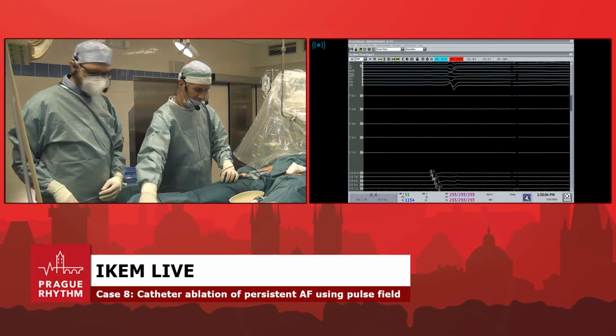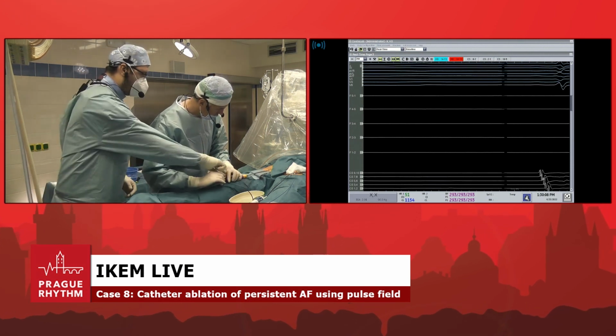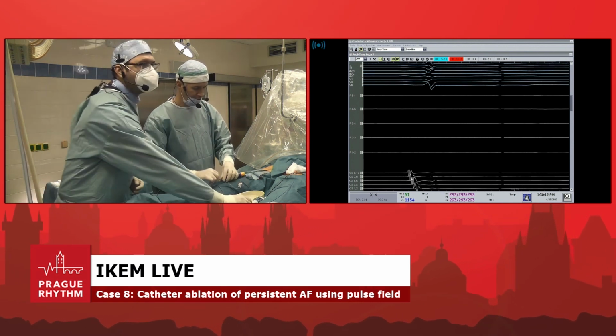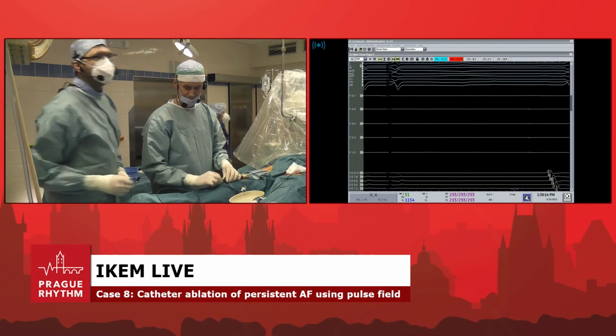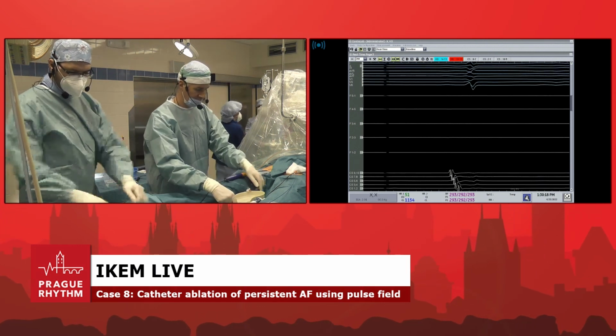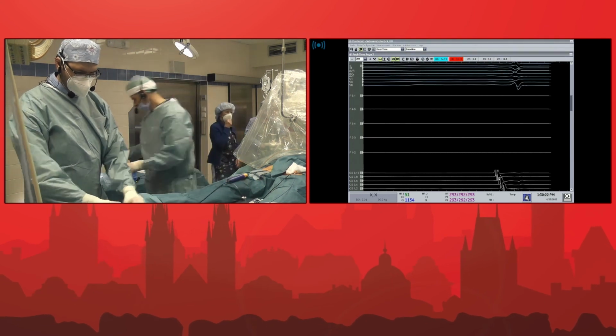Let's go. It terminates. Sorry? We don't have the flow. Did you cardiovert the patient, or did it terminate spontaneously? No, it terminates spontaneously. Okay, so I think we will stop now. Thank you, and we're going to give you the transmission. Thank you very much for the demonstration.